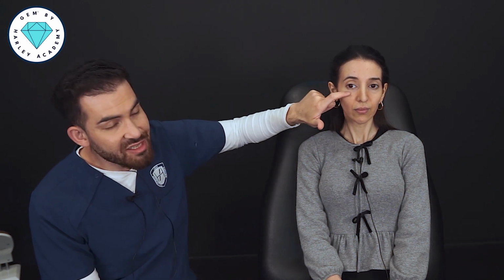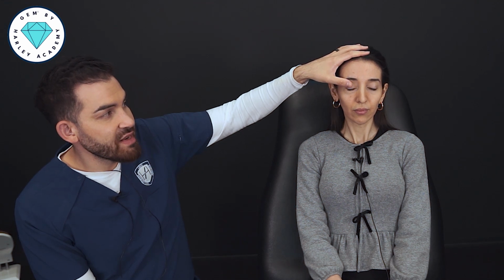Continuing that into the under eye, I think the tear trough in this case is a really good treatment target. We can see these shadows under the eye, and in this case that is due to volume. The reason I say that is because if you close your eye for me and I press here, we do have a little bit of bulging of the intraorbital fat, but there's also a very clear volumetric change as well. And so I can address that with filler. I'm quite confident in that.